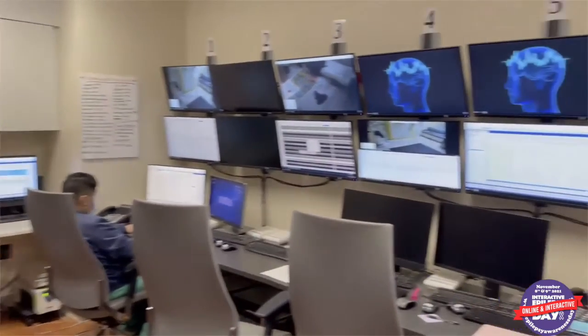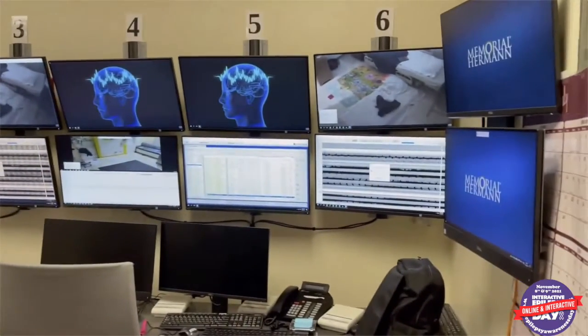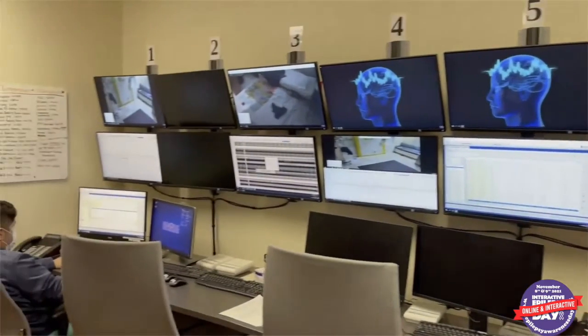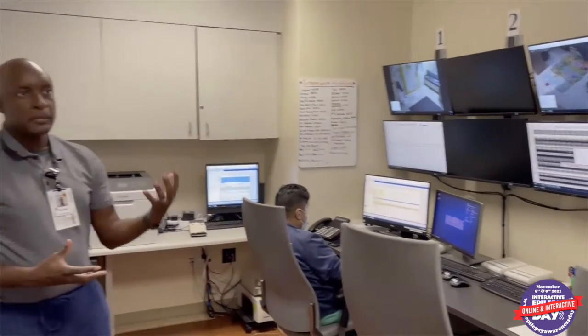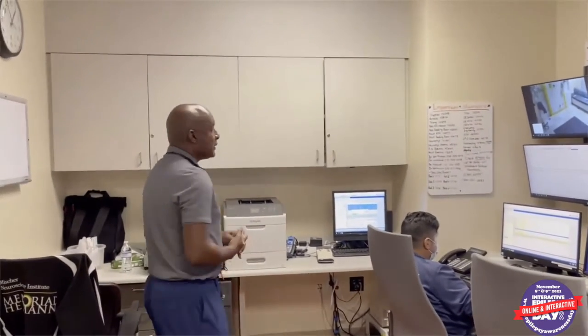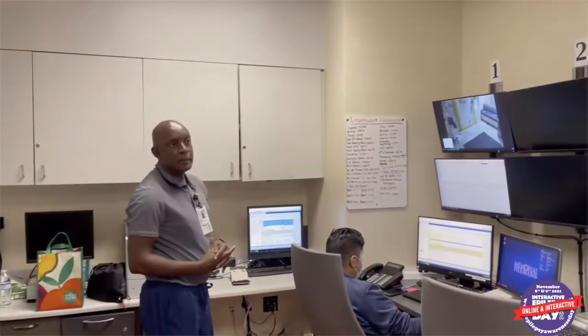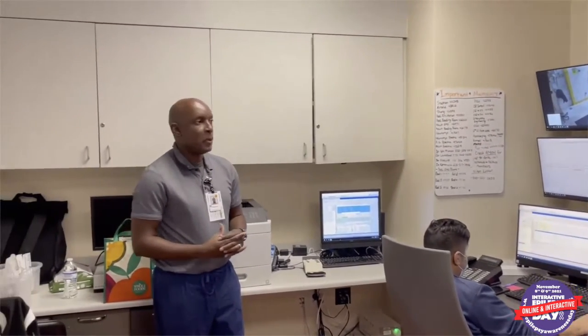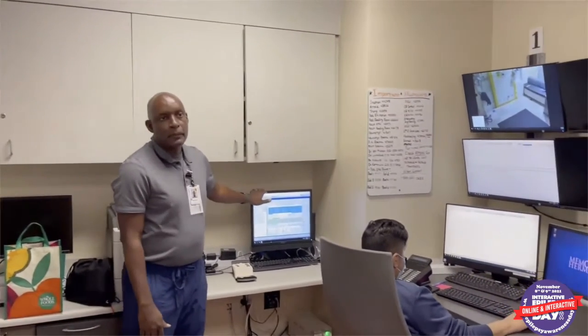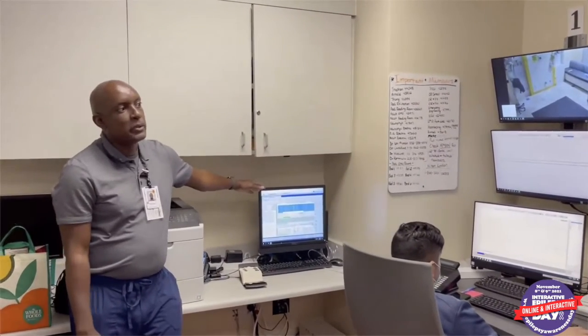hospital. And we have a monitor on the wall where we can live monitor our patients. Also with these monitors here, we are capable of live monitoring any patient around the hospital who's hooked up to EEG as well. Previously, we showed you a playroom where our younger folks can go and have a decent hour away from the room when they are on EEG. This is where we monitor those patients. So this is directly connected to our children's playroom.